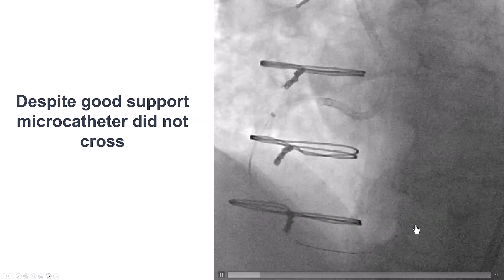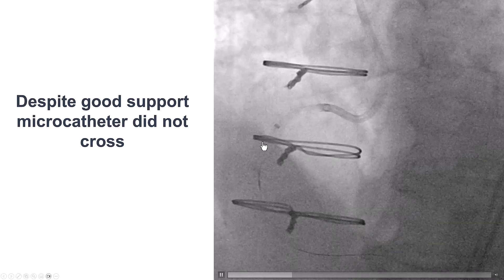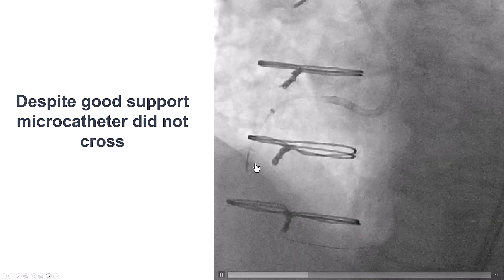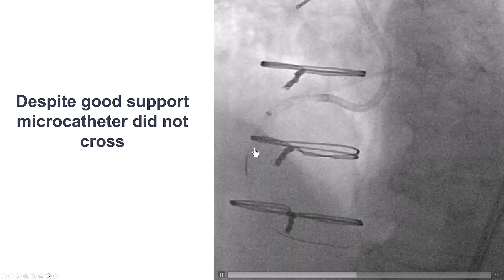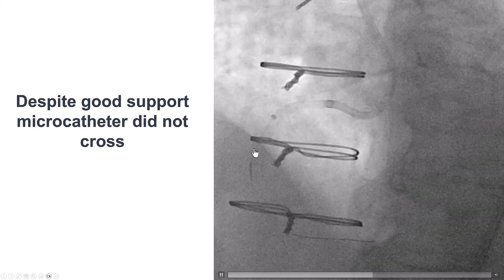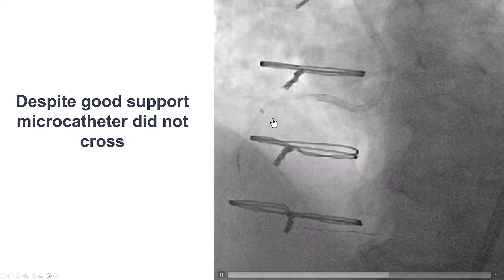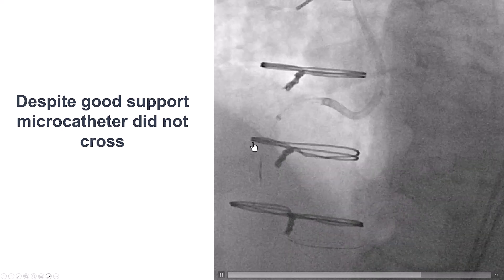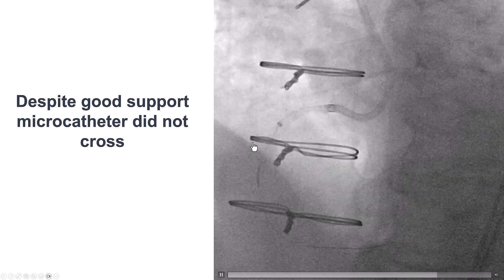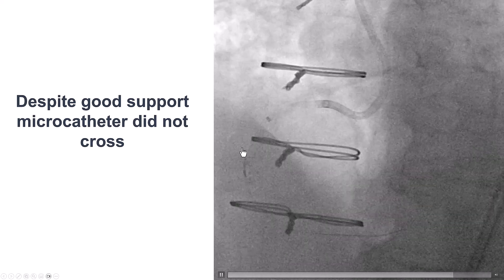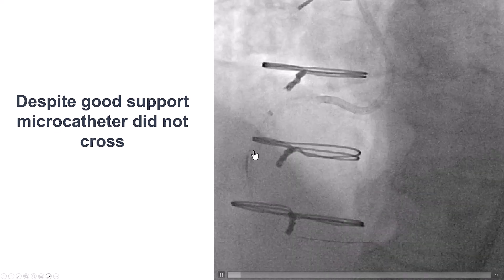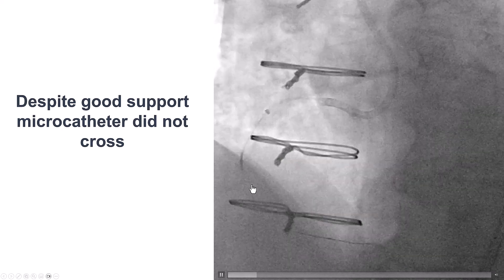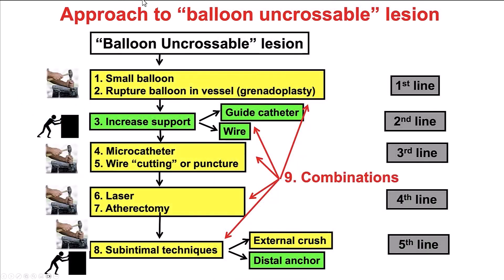This complex CTO that had been failed three times before was crossed fairly easily with antegrade wiring. However, as is often the case when antegrade wiring works, we could not advance the microcatheter through the proximal cap — it was microcatheter uncrossable. So we followed the algorithm.